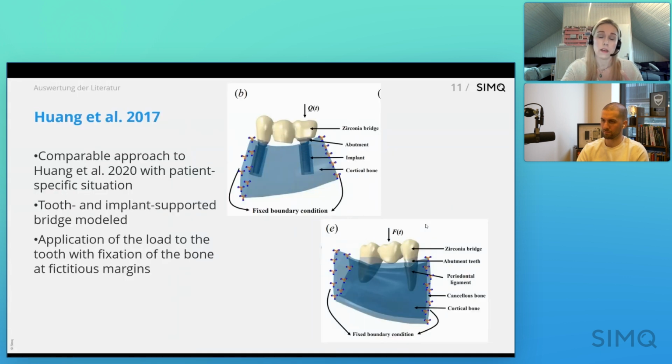And just to piggyback on that, specifically the dental workflow that I'm going to show you, we have to take several things into account. And what we do at SimQ, since it's medical device related, we take all of those digital twin simulations, and we use sources like OpenSim, the benchtop testing that I referred to. Another example is with the dental workflow. You have different kinds of abutments, they're called, and some are metal and some are tooth supported. So the bridge or the crown can sit on top of a metal piece that's inserted by the dentist, or it can sit on a tooth that's maybe ground down a little bit, your natural tooth.